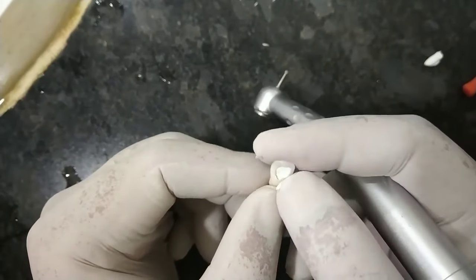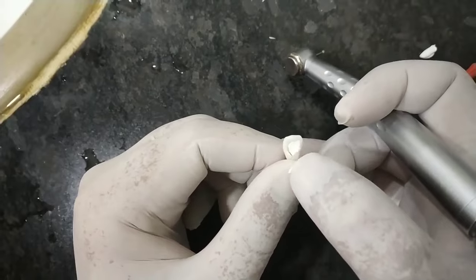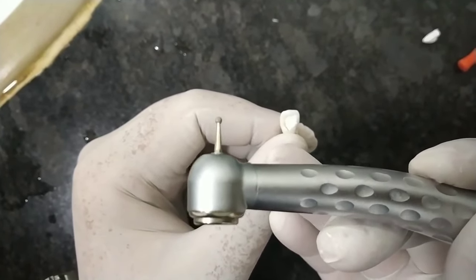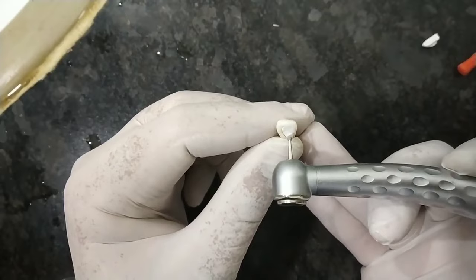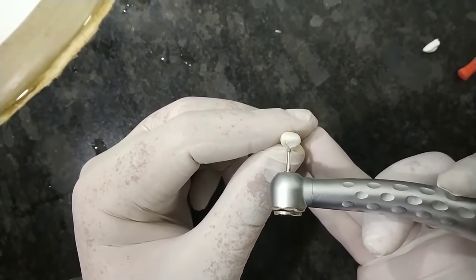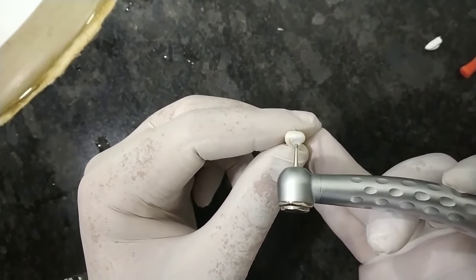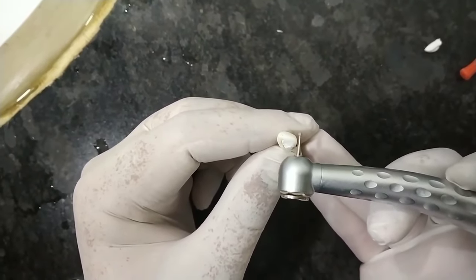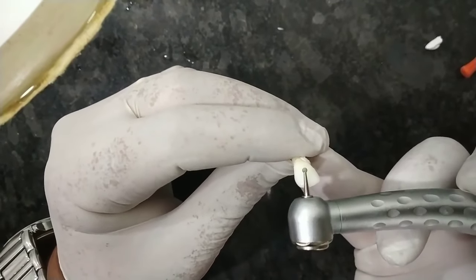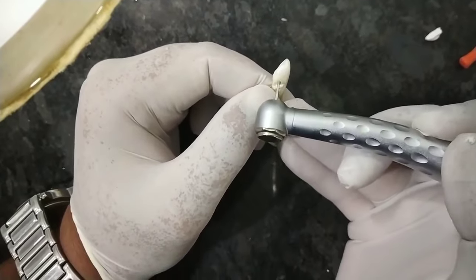The first tooth I am demonstrating for root canal treatment is the upper anterior tooth. You have to take a number 4 round burr. Whenever approaching the root canal, we approach from the palatal aspect and punch a hole on the center of the cingulum area. Keep in mind not to go too much around this, otherwise there will be labial perforation as shown in the CBCT. Your burr should be limited till the CEJ of the tooth — this is the cement enamel junction.